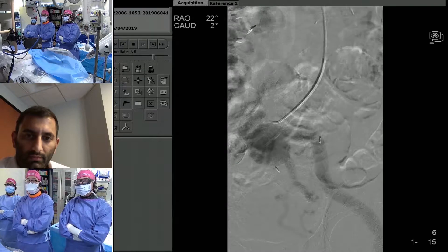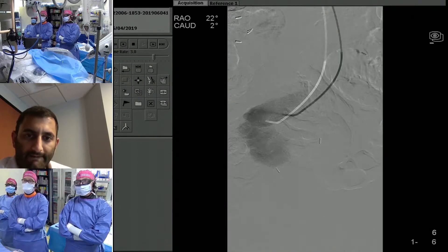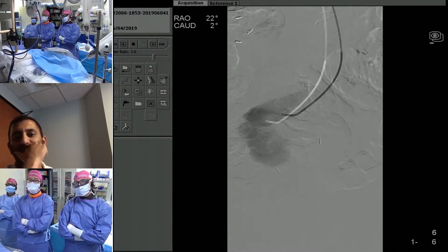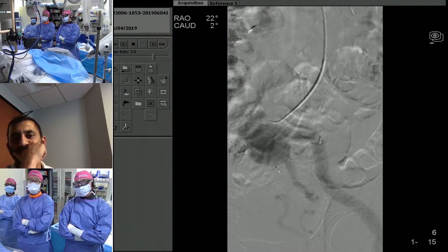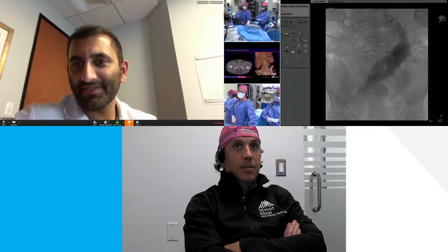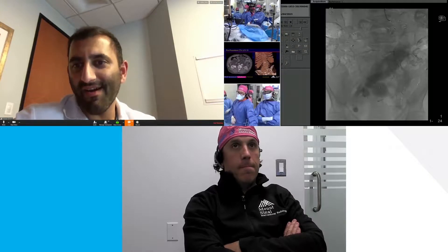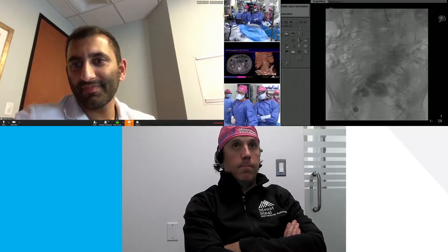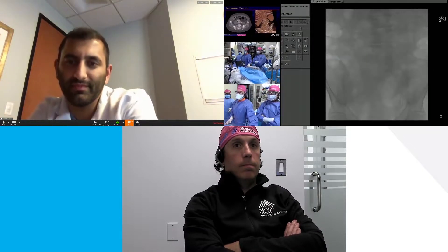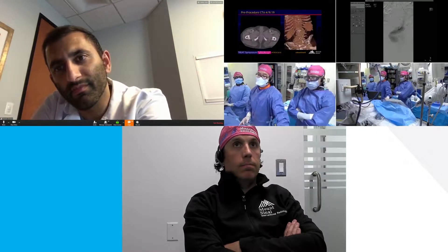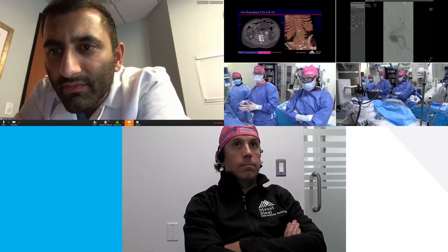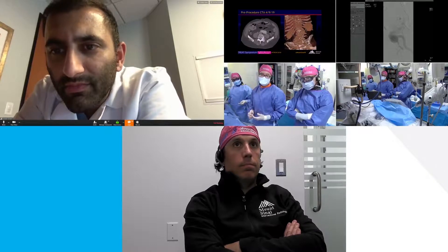The biggest concern is that it's not like a standard IBD in the sense that we have to extend these limbs pretty far down into the hypogastrics — that's tough. On the right side, you can see it's ectatic all the way down to its bifurcation. Here at the first run, you can see a very tortuous aorta. We'll probably take a selective picture of the right hypogastric artery on the way out, but we started by focusing on the left. We're down onto the left side a little better and can kind of see the origin. You can't really see the origin of the left hypogastric very well, but you can see what the outflow vessel looks like.